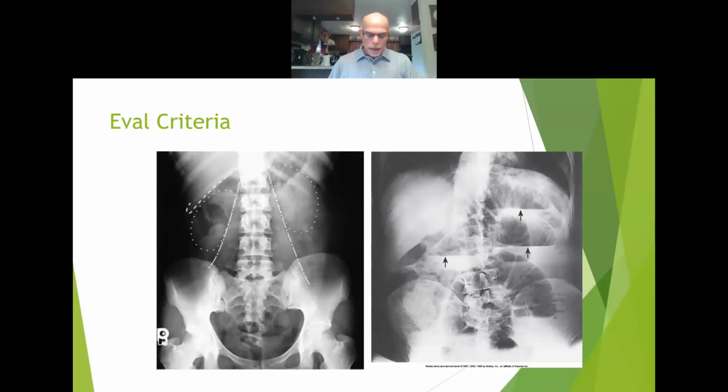On page 139, it says when the kidneys are not of primary interest, the upright PA projection should be considered. Compared with the AP projection, the PA projection of the abdomen greatly reduces the gonadal dose. That's the main primary reason we were trying to do a PA. I told you the problem with doing obese patients that's got a little beer gut there. That's going to be a problem because the thorax is going to be further away and your big belly is going to be there. So you're going to run into that problem.